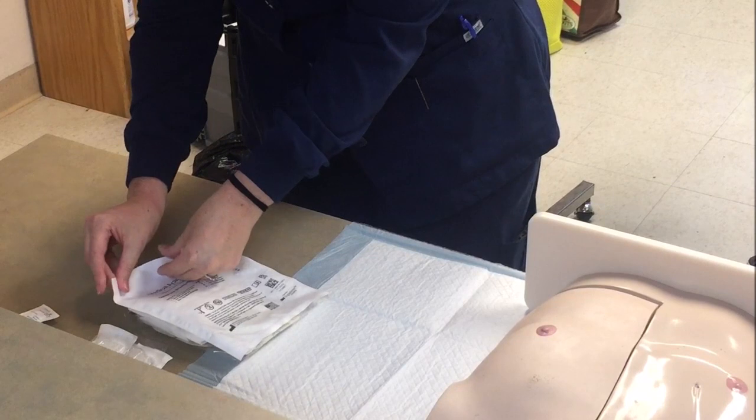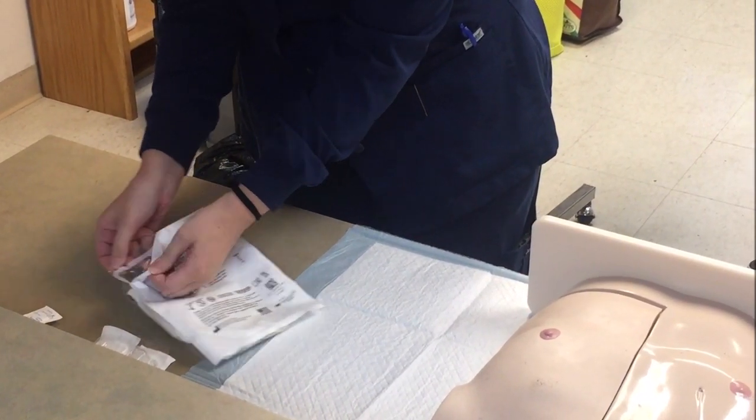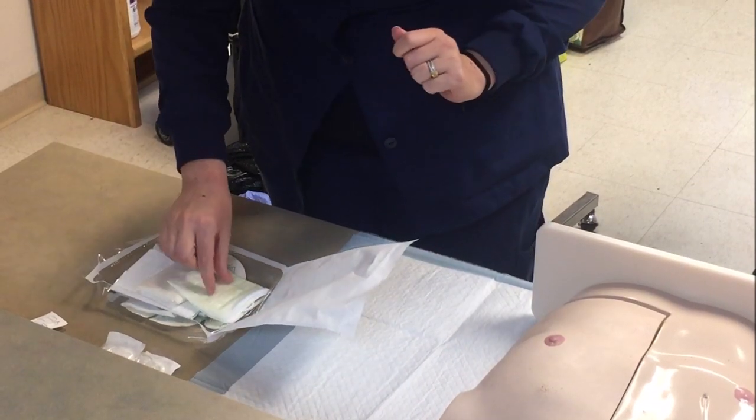Always assess the site for signs and symptoms of infection such as erythema, induration, and pain. Based on your palpation and site assessment, you will select the appropriate length of a non-coring Huber needle.